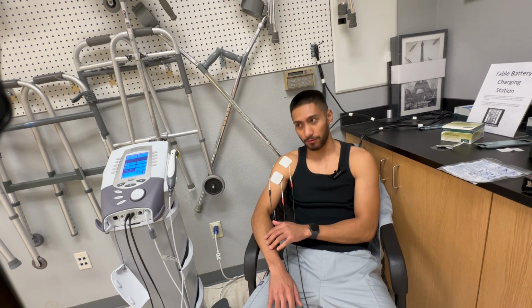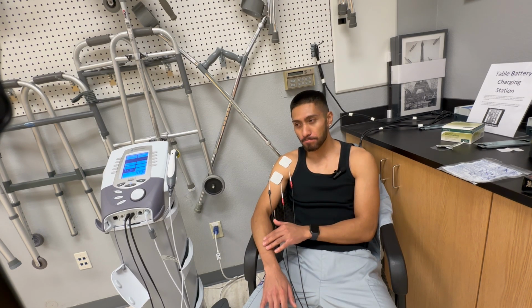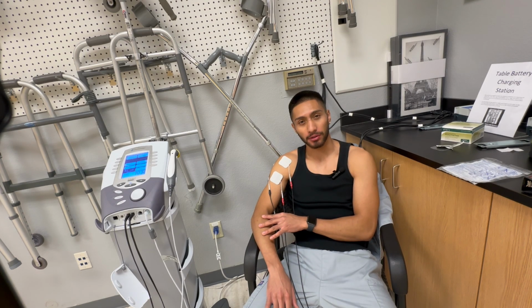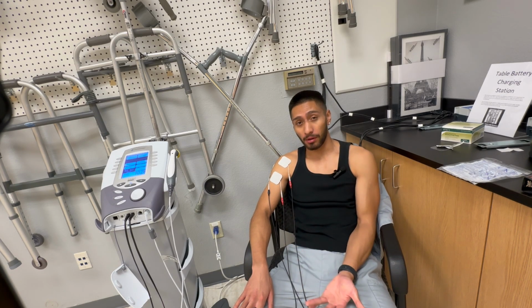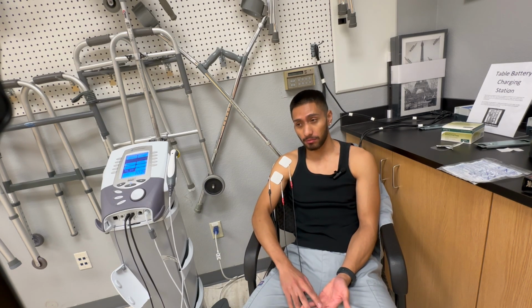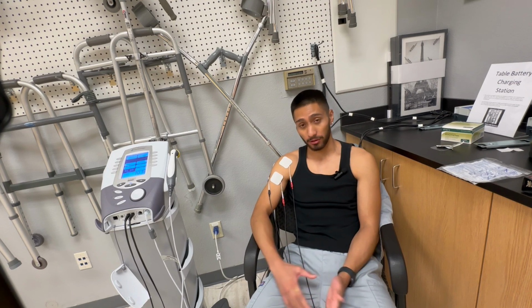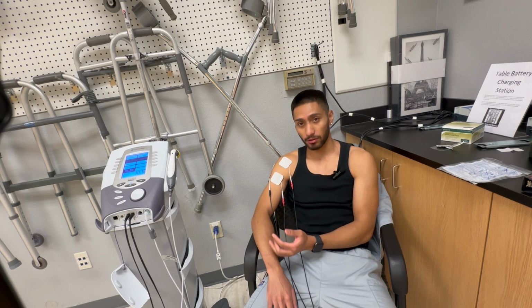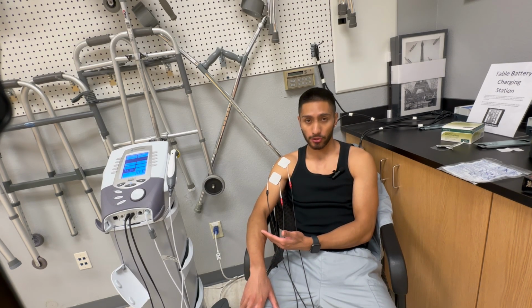It's as if someone is rubbing something rough on the skin, like a stone. I'd say it's like a skipping stone on the skin. That's my best way of describing my tingling sensation. It might be different on different patients. Once again, feeling and intensity levels vary from patient to patient. But primarily, it's tingling sensation, not too much muscular contraction or muscle twitch when it comes to endogenous opioid release.